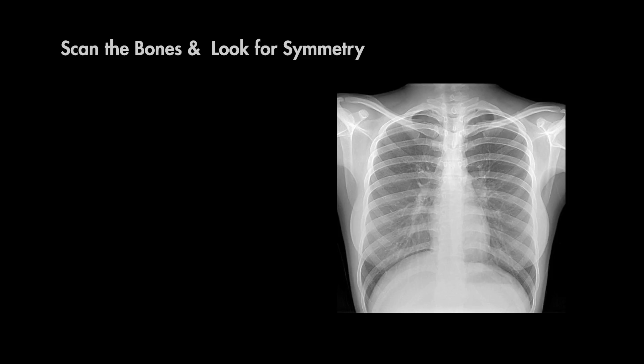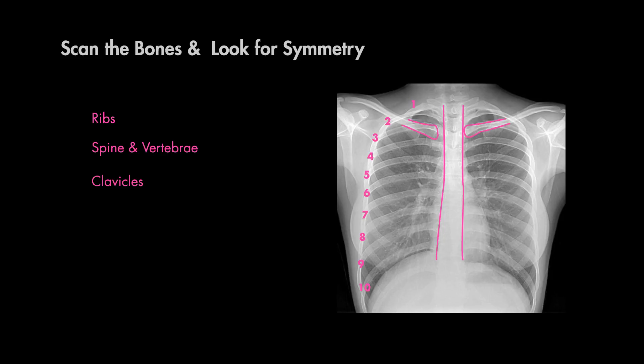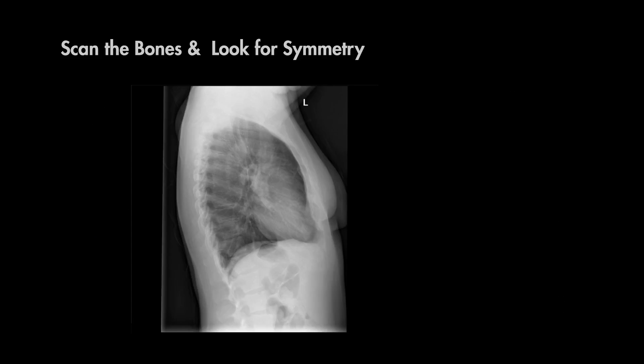First, scan the bones and look for symmetry. You'll see ribs, the spine and vertebrae, clavicle, and both scapula and humerus. On a lateral film, you'll also be able to see the sternum in addition to lateral views of your ribs, scapula, and vertebrae.